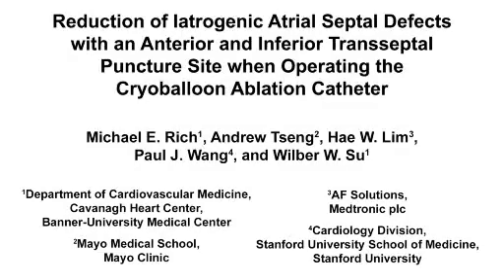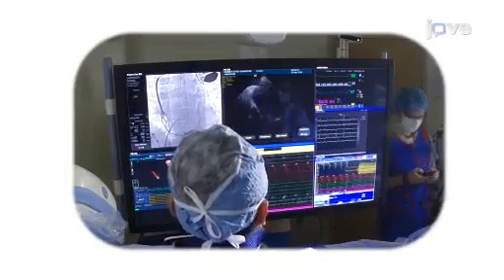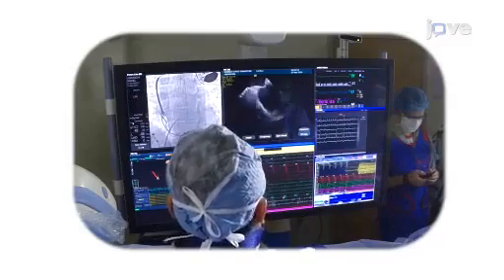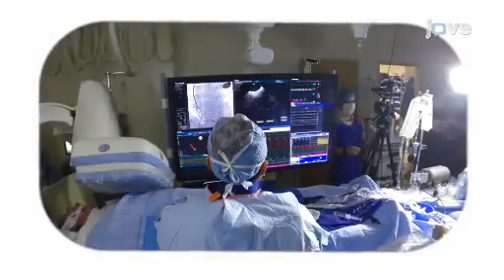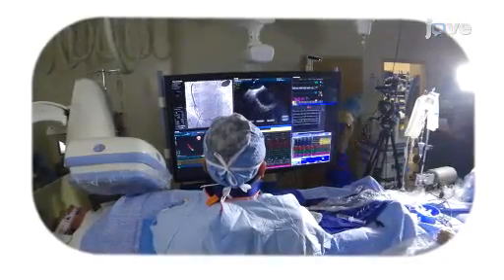The overall goal of the following experiment is to facilitate effective cryoballoon occlusion, which will then result in pulmonary vein isolation and return to normal sinus rhythm. This is accomplished by first finding the fossa ovalis, or FO, location. Next, the location low and anterior to the FO is identified.